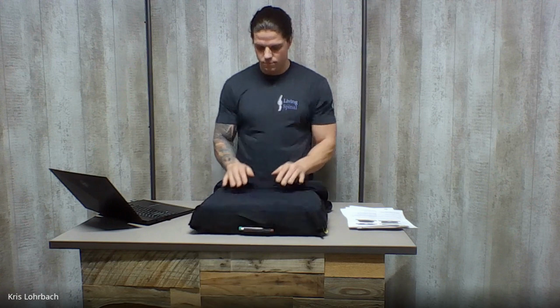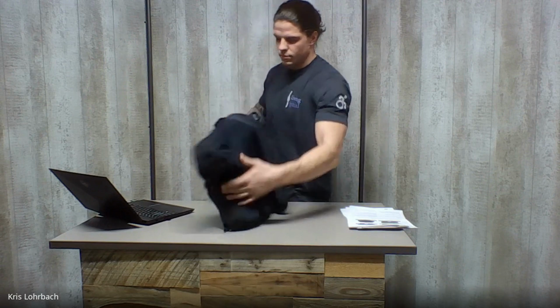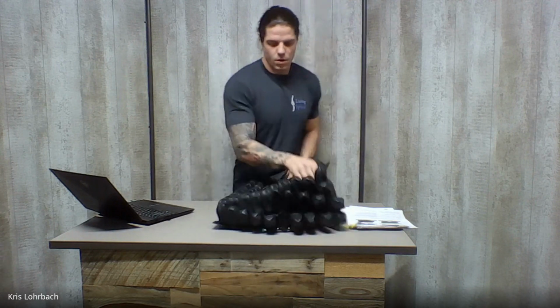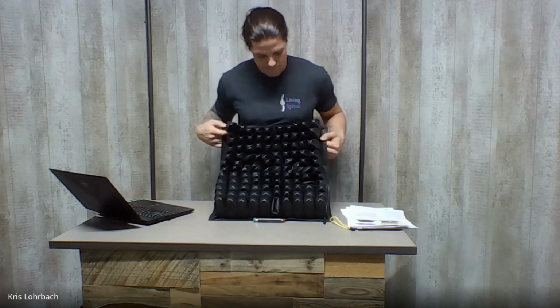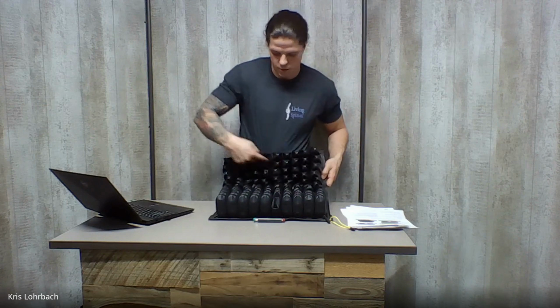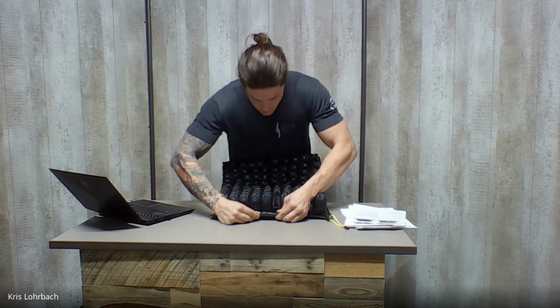So imagine like a diagram, right? You get a cross in the middle, and there's 4 sectors. So there's 4 quadrants in that cushion of air cells, and all the air can flow in that quadrant, and in that quadrant, and in that quadrant, but only in that quadrant if the red is on. Right now it's pushed to red, and so the air will stay in each of the quadrants where they are. And if you push it to green, then they can flow everywhere.